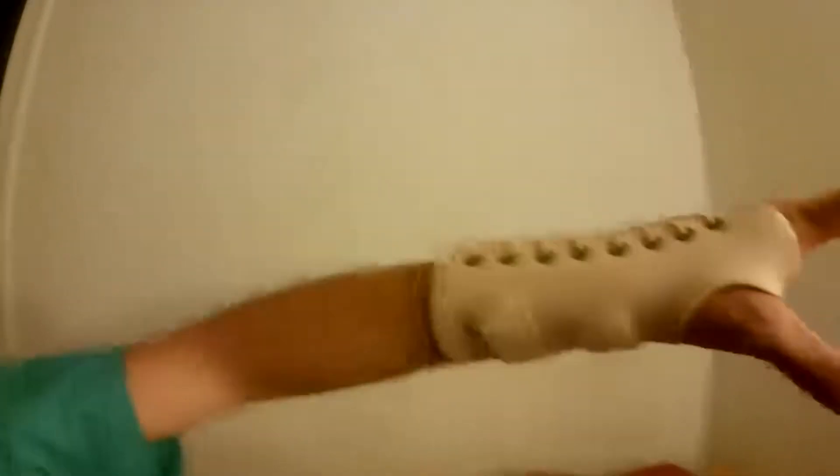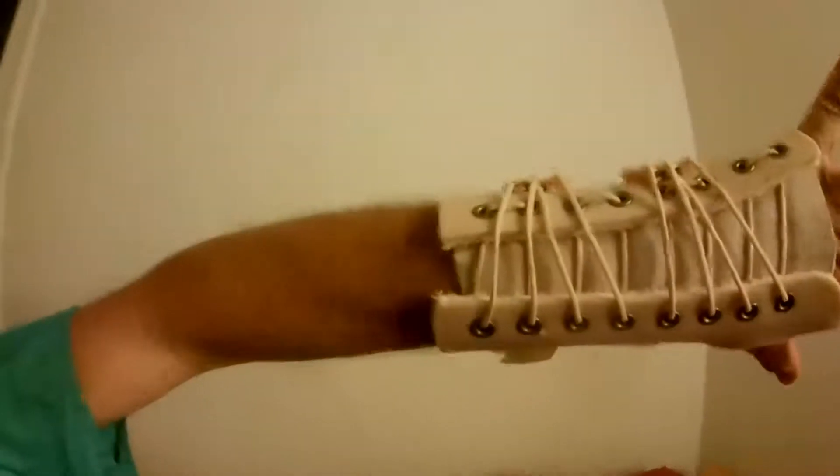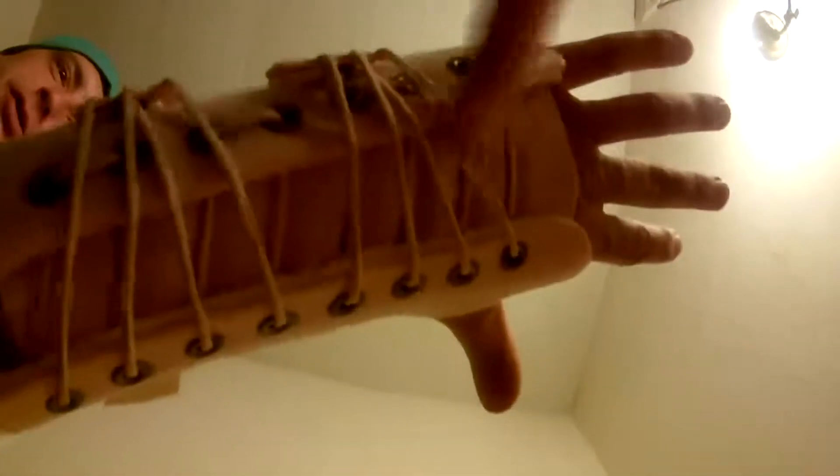I bought this from a Walmart store back in the 1990s, and I forget which brand or manufacturer this wrist brace is, but this is a pretty unique one. This wrist brace features an elastic fitting for the hand inside, and also these elastic strings.